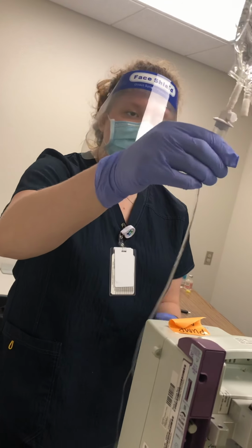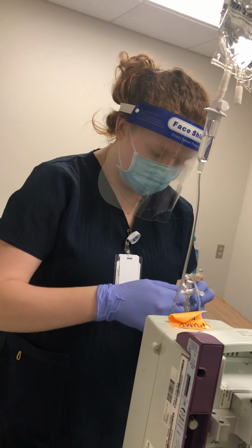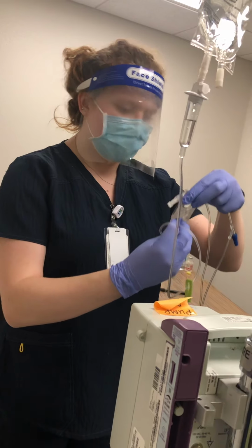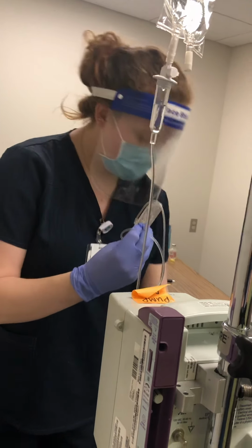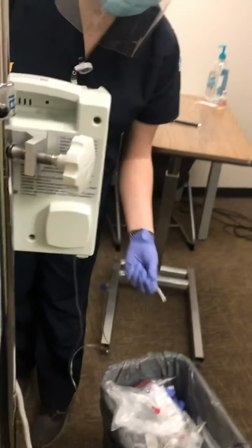We're going to fill our drip chamber about halfway, getting our air out of our line.